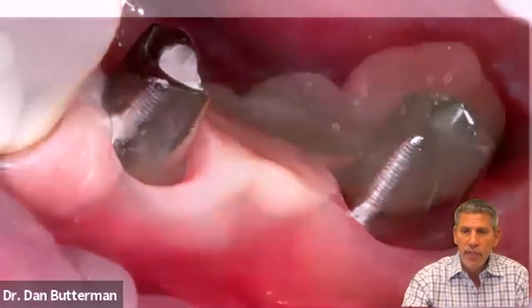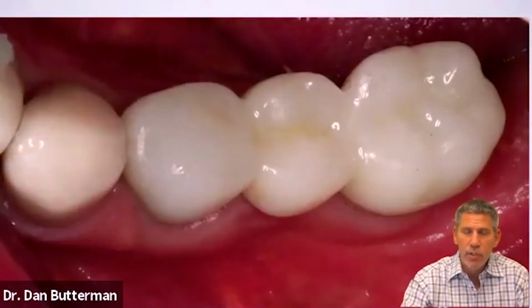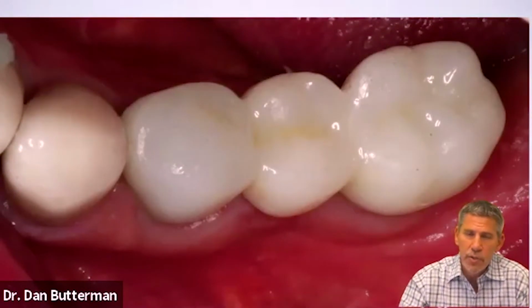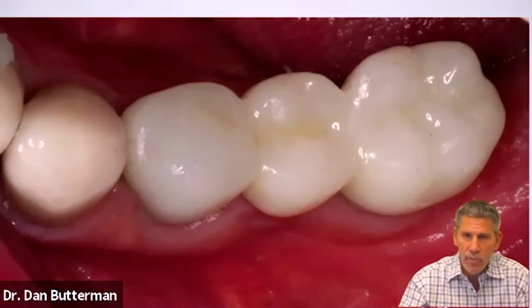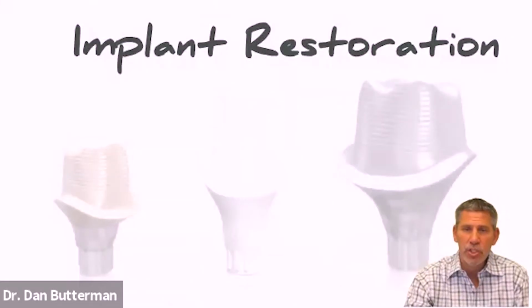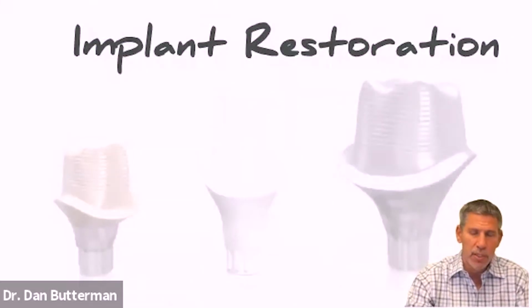And then finally, we have a perfectly passive fitting bridge. And these fit incredibly passive because the accuracy, we're under 30 microns of error with this. The accuracy is probably better than I can get on a patient like this that gags and has a big tongue and is full of saliva. It's probably better than I can get with a physical impression. And again, it just made my life and the patient's life quite a bit easier.